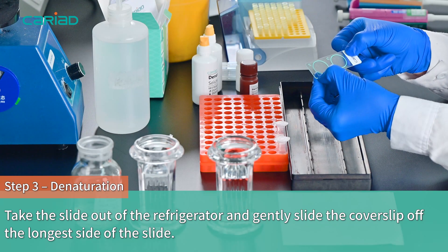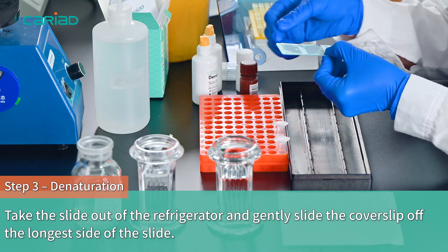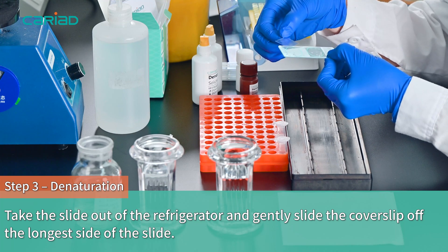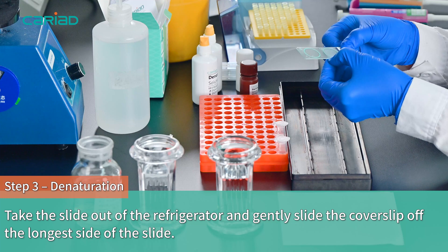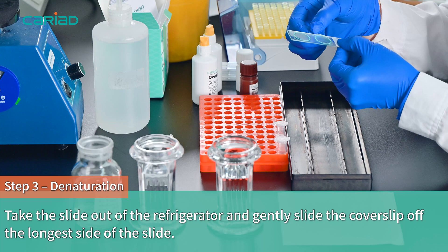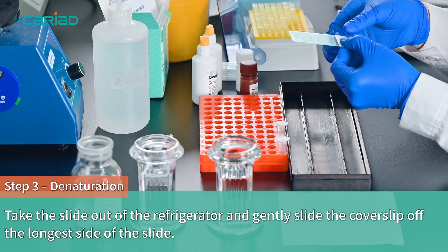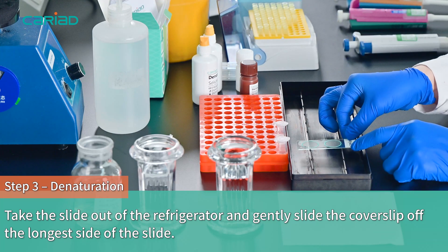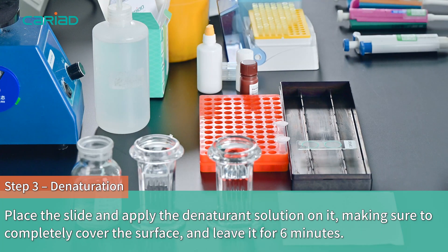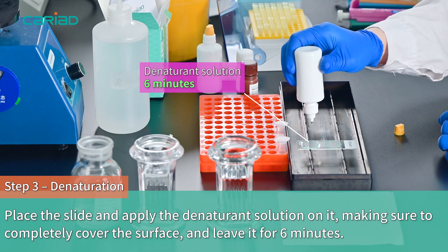Step 3. Take the slide out of the refrigerator and gently slide the cover slip off the longest side of the slide. Place the slide and apply the denaturant solution on it, making sure to completely cover the surface, and leave it for 6 minutes.